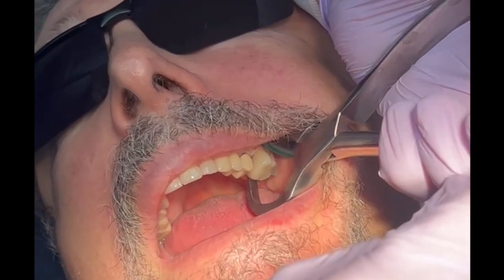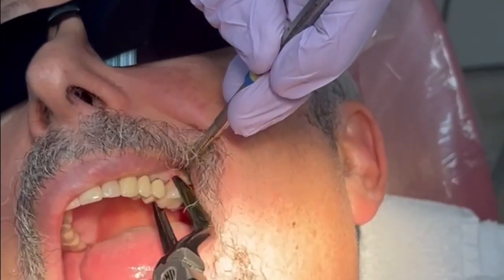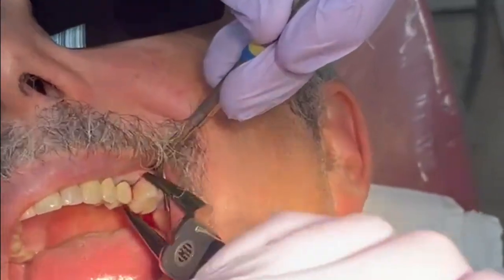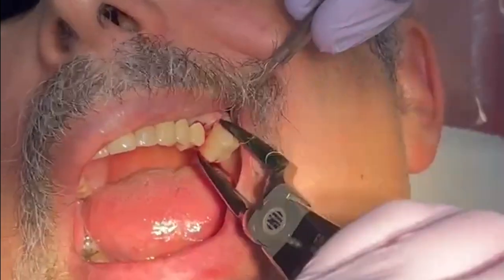I'm very carefully trying to remove this tooth in real time, removing the tooth without removing the crown, without sectioning the roots. And we have very divergent roots, as you can see.